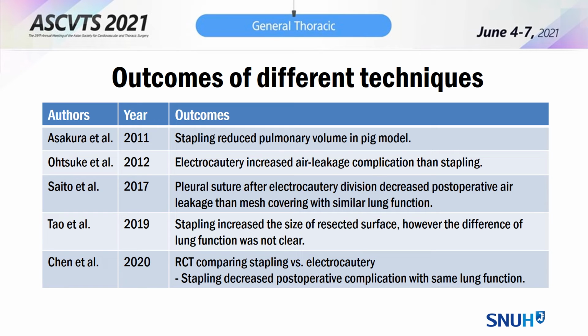So currently, recent papers report that stapling reduced complications, especially for elderly patients. However, the lung function difference was not so great. So generally, it is now believed that stapling is comparable to electrocautery and reduces complications.